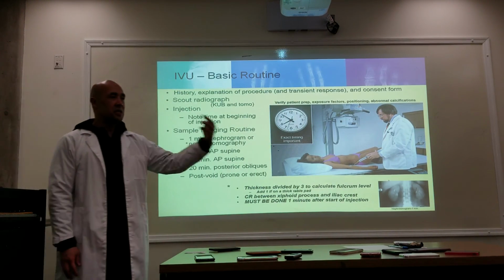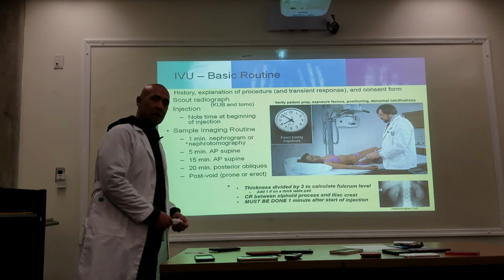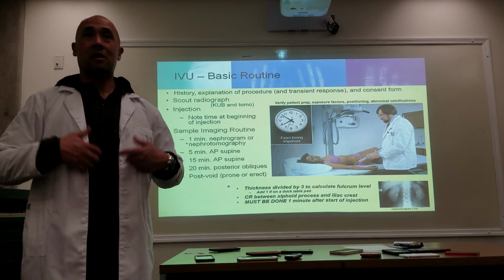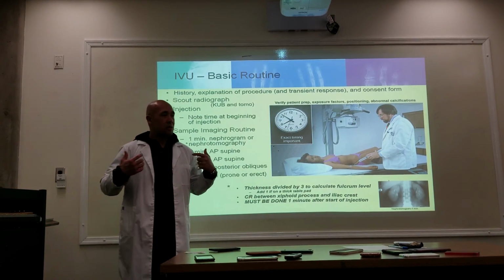So we get our patient into the room. We're going to get them undressed. How undressed are we going to get them? A little bit, a lot? Waist down. Okay, waist down. What else? Possible bra. So get rid of the bra if they're female. Can you keep their underwear on?